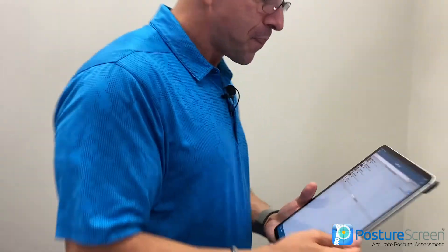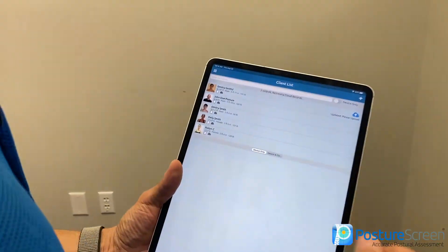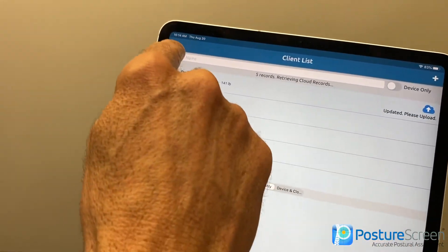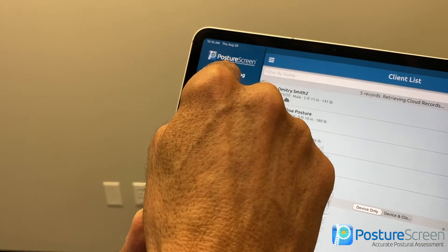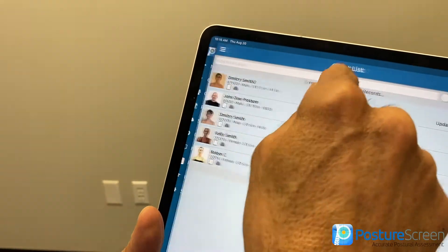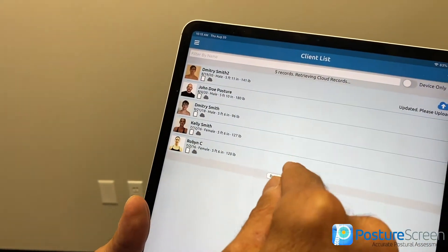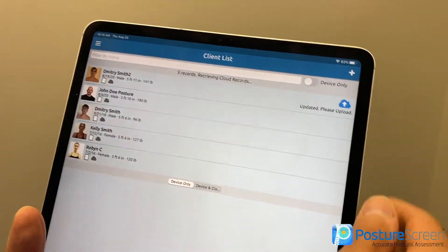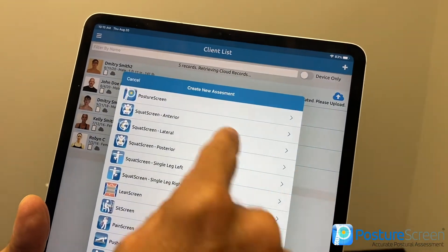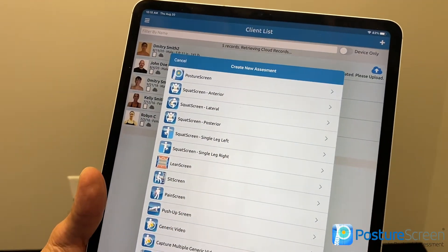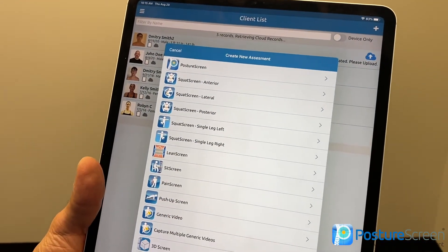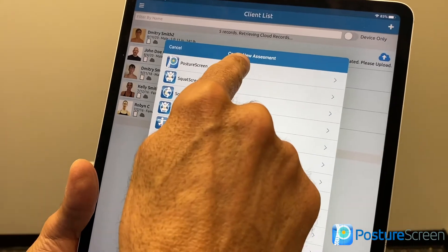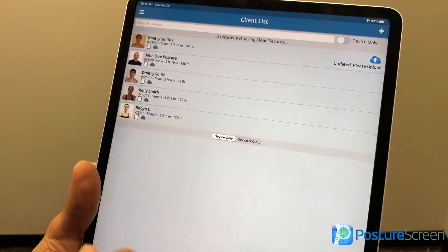So this is how we get started. The first thing we're going to do is come up to the menu. We can hit New Screening here, or if we're in a client list, we can hit New Screening there. If we hit New Screening, you get an exam list or an assessment list. I'm going to go ahead and choose PostureScreen.